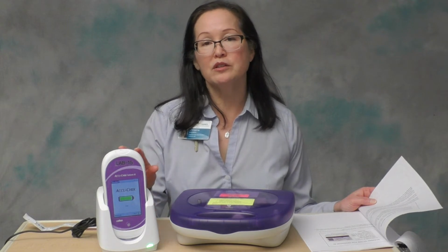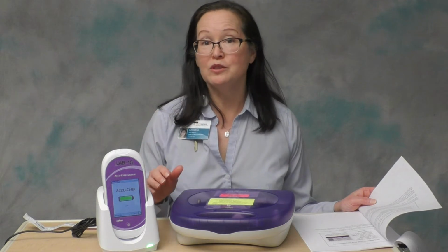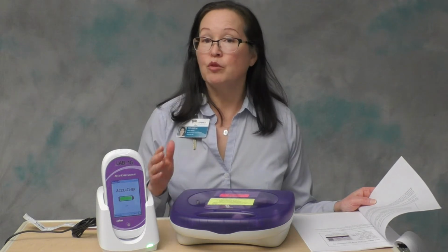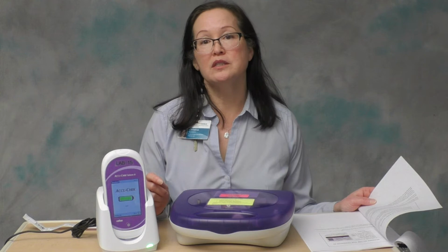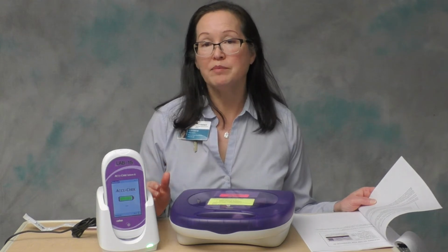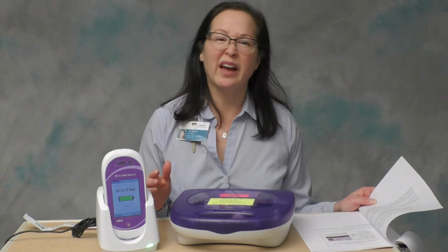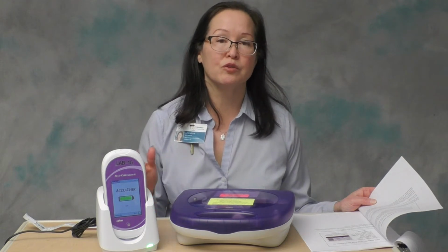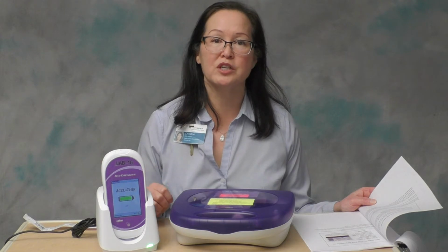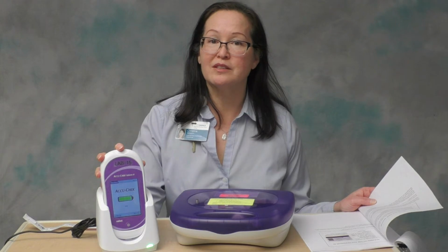I always recommend to users that the first time you see that message pop up, run the QC. It may be several weeks before you have a patient that needs glucose testing again, and if your certification has lapsed, you will not have access to patient testing. You will continue to have access to QC testing for 30 days past your expiration. But if you don't run the QC, you won't have access to patient testing when you need to run it.